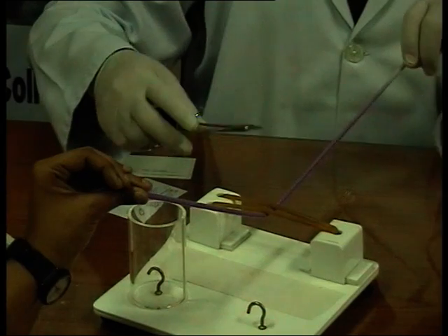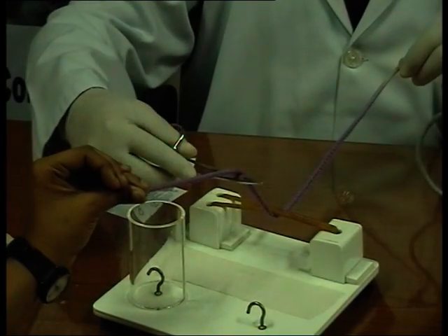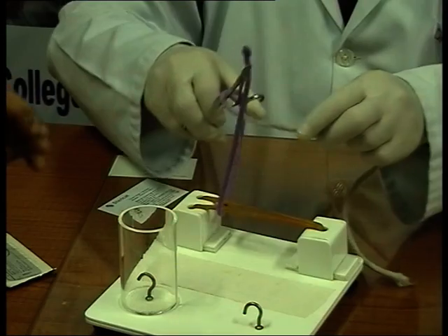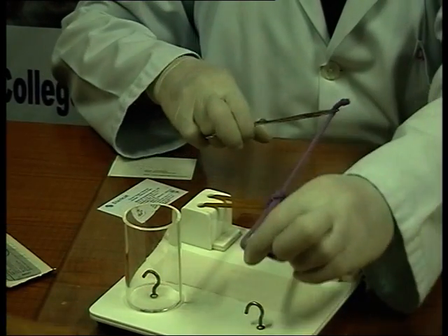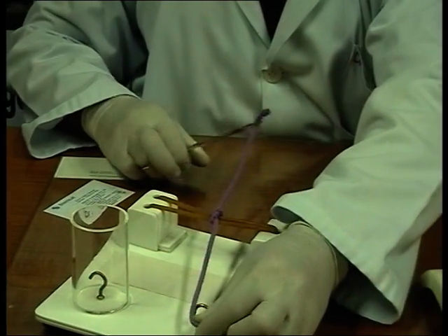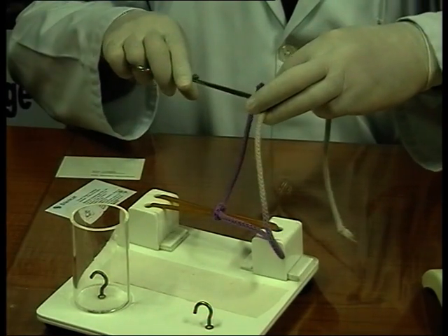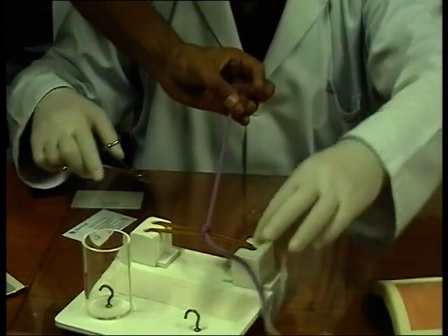Now, how do I stay within the V? See, I won't go here, this is a mistake. I won't go here, this is a mistake. I'll stay within this. I'll take my first throw, give me the tip. Now I'll take the tip and I'll cross. Once again, this has to be held. Can you come here and hold this with the left hand? Left hand, left hand. This is the right hand.